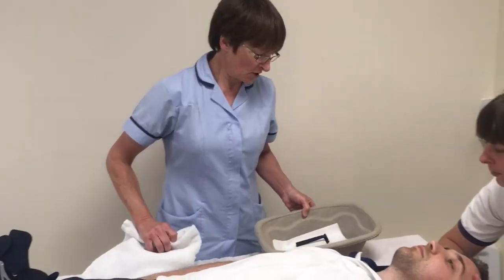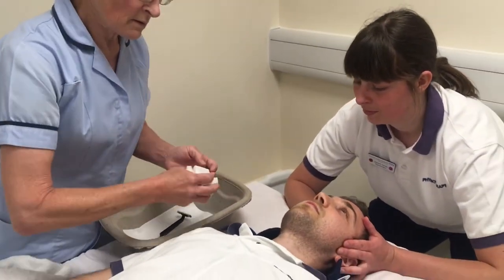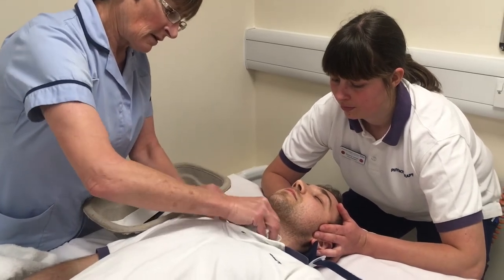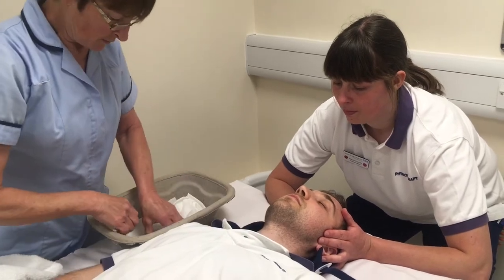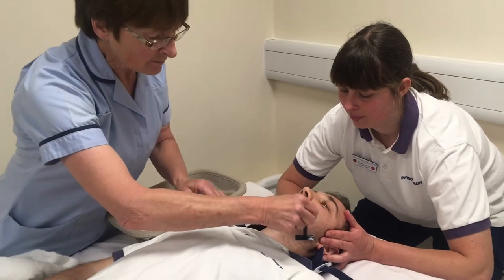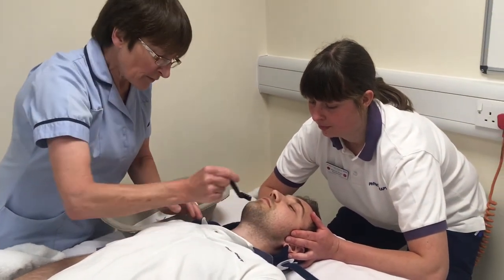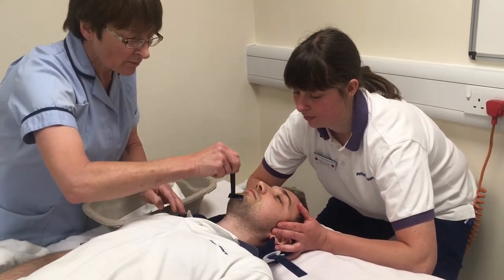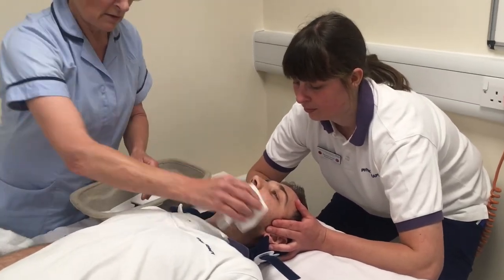We're going to get our wash stuff that we've prepared. Wash gently around the neck and down onto the top of the chest. At this point it's probably a good idea to shave your gentleman patient — just gently shave upwards to remove all bristle and stubble from the area inside the collar.